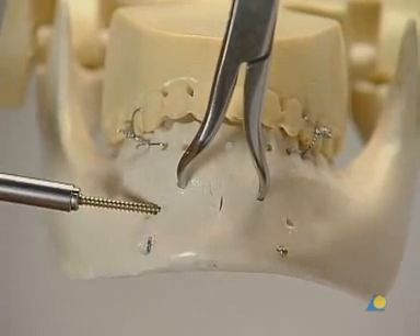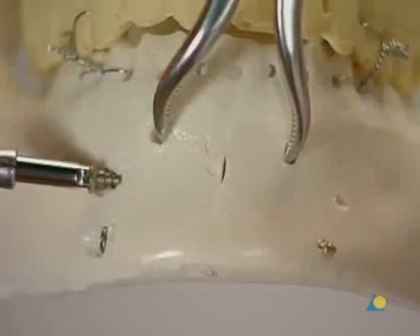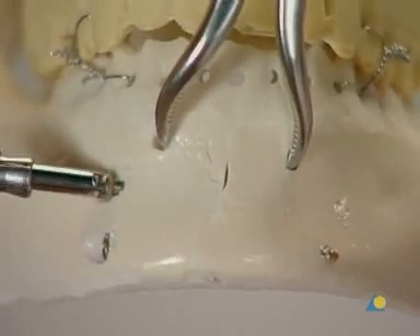The location for the second screw has to be carefully chosen so as not to harm dental roots. This screw can be placed from either direction using the same procedure.